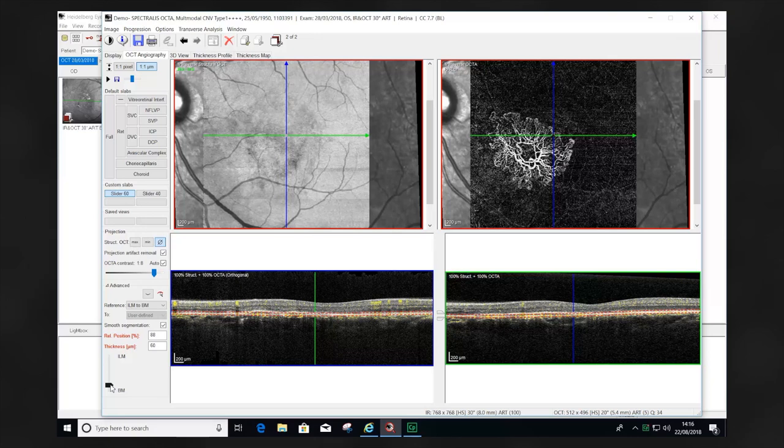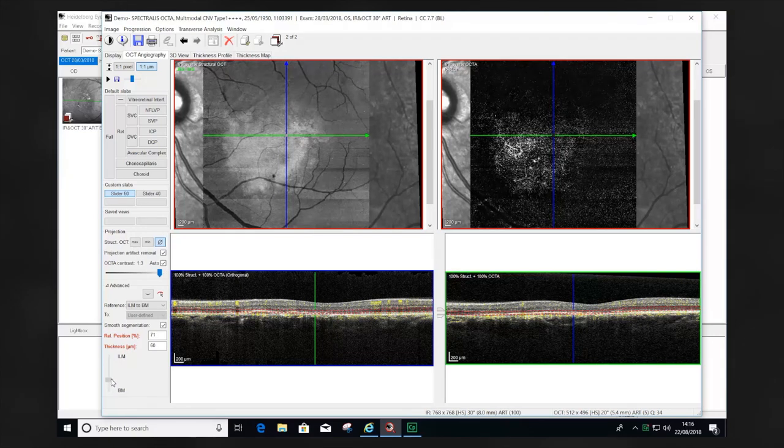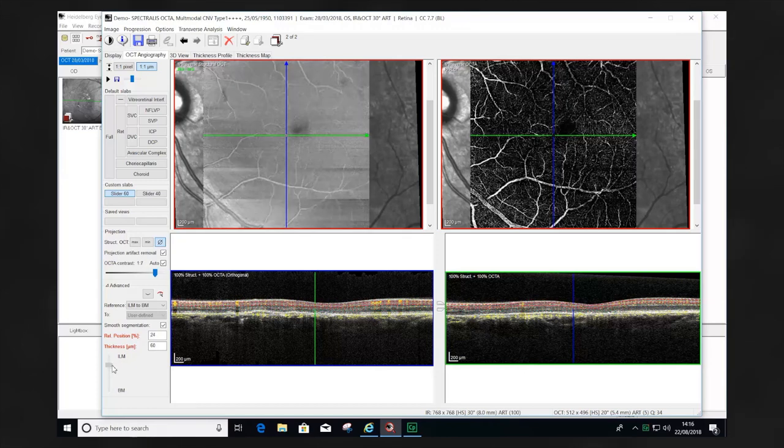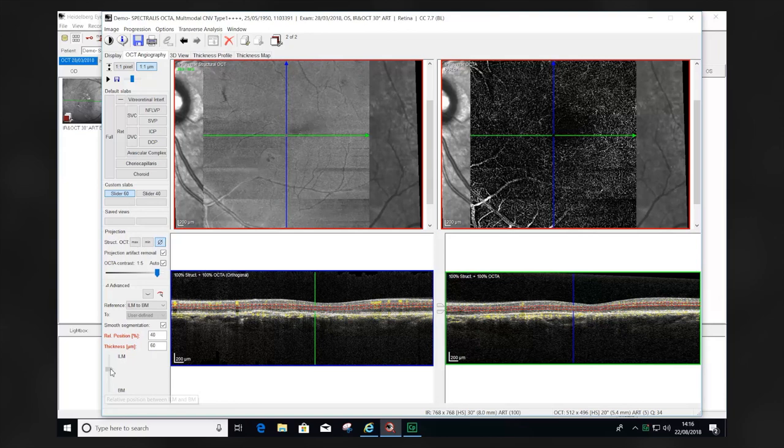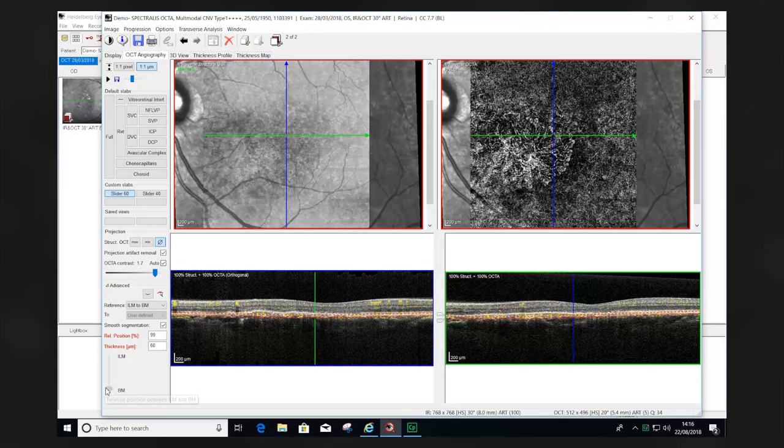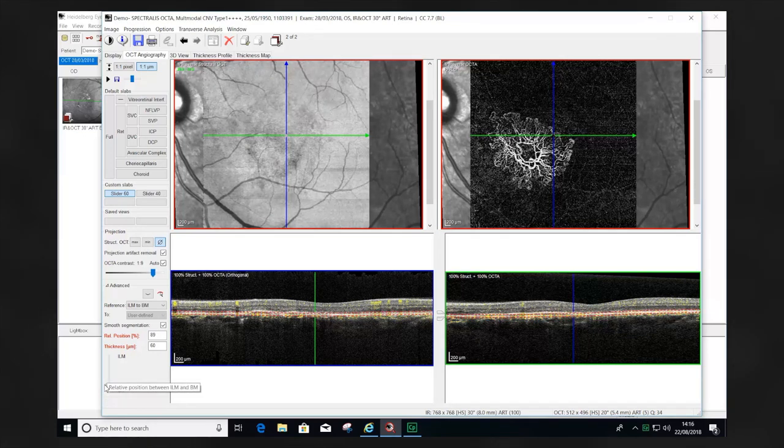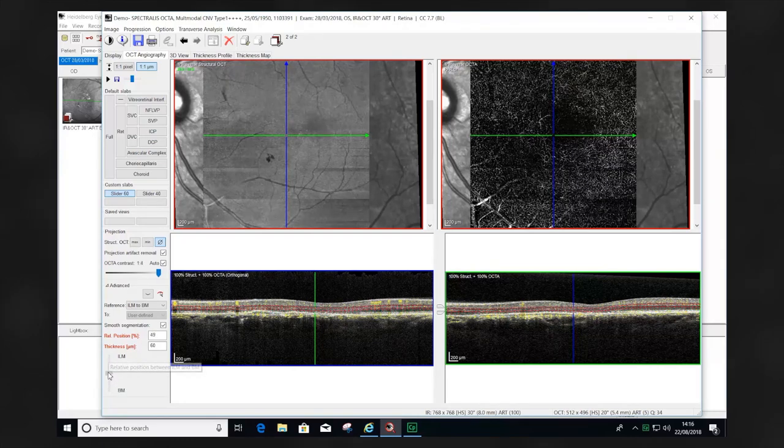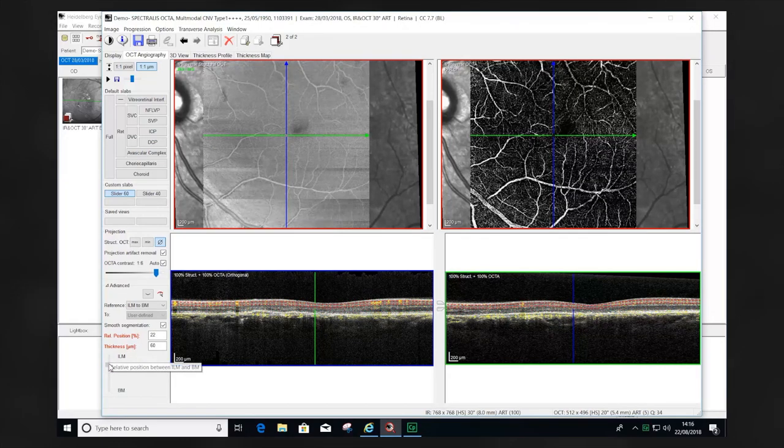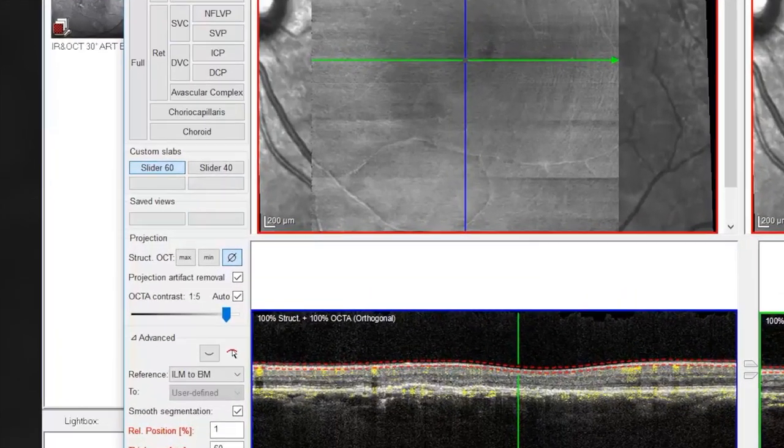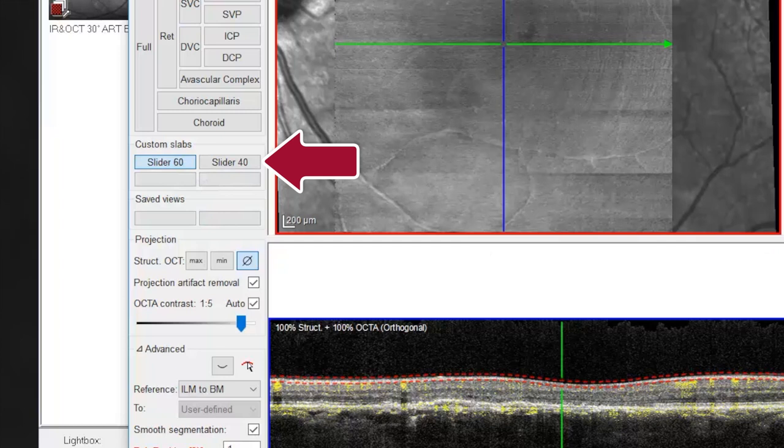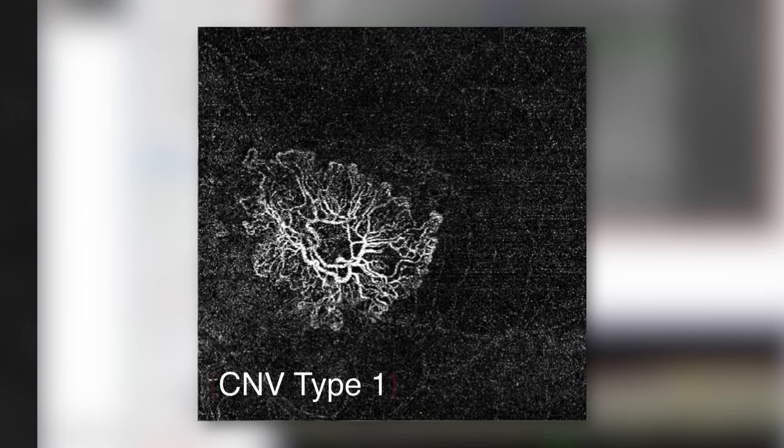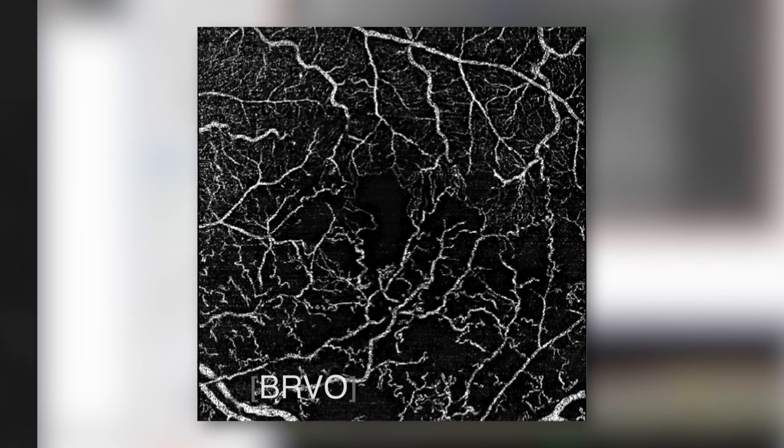The slider tool in the bottom left of the window is moved up and down. This moves the segmentation slab up and down through the B-scan, allowing us to visualize different enface presentations at different locations. Using the slider tool is particularly helpful if the segmentation is suboptimal. It also helps visualize the retina in a three-dimensional way. Within the custom slab section, two slider tools have been created: a 60 micron thickness slab and a 40 micron thickness slab. 60 microns provides better visualization of choroidal neovascularization and provides a little more depth penetration beneath the RPE into the superficial choroid. The 40 micron thickness slab is preferable for visualizing retinovascular disease and intraretinal changes.